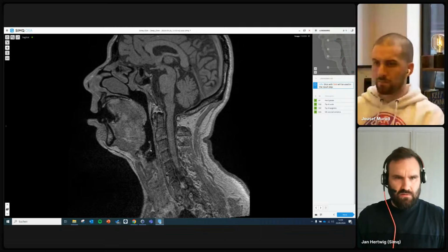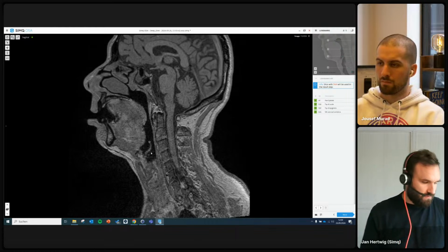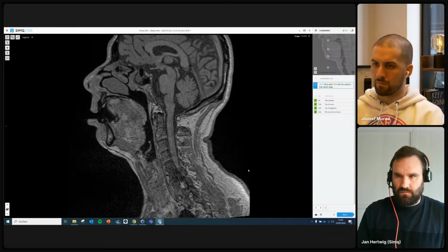We have different risk factors on why a patient could suffer from obstructive sleep apnea, or yes or no, and that's what we want to find out with the software. So the anatomical reasons, and for that we have to give some information for the simulation.